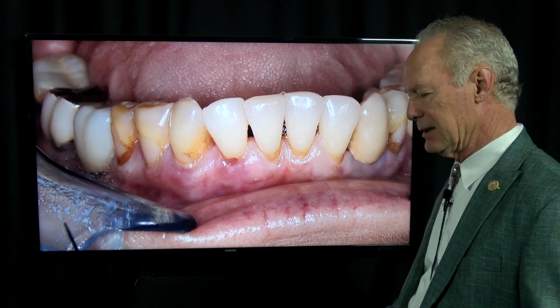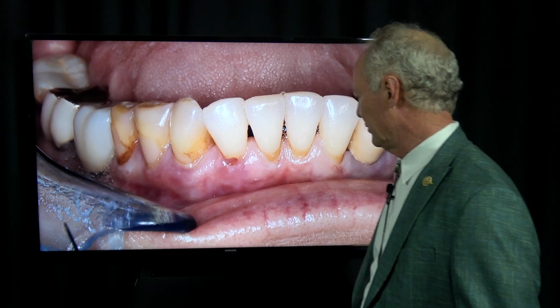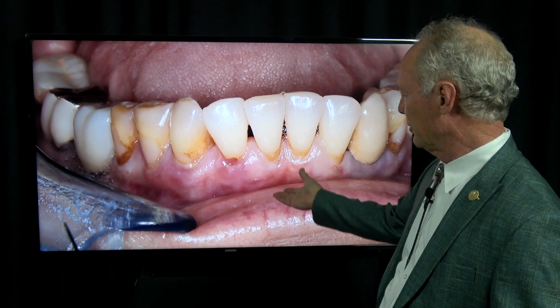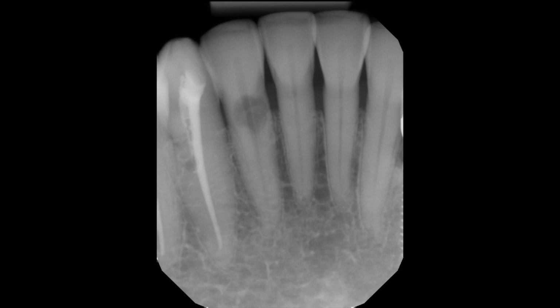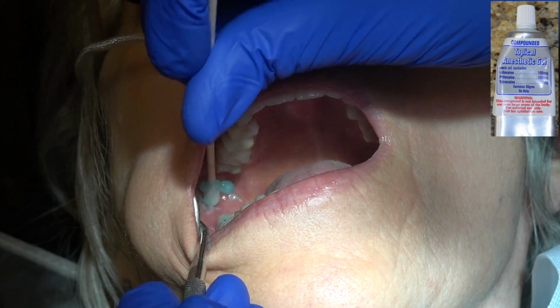It's funny, when I'm placing implants, I often place the implant at the time of extraction if it's a single rooted tooth. In this case, the extraction was so difficult that I didn't feel like it was appropriate to place the implant at the time of extraction. But many times the extraction, especially in an endodontically treated tooth or an ankylosed tooth or internally resorbed tooth, the extraction will take longer than the placement of the implant.